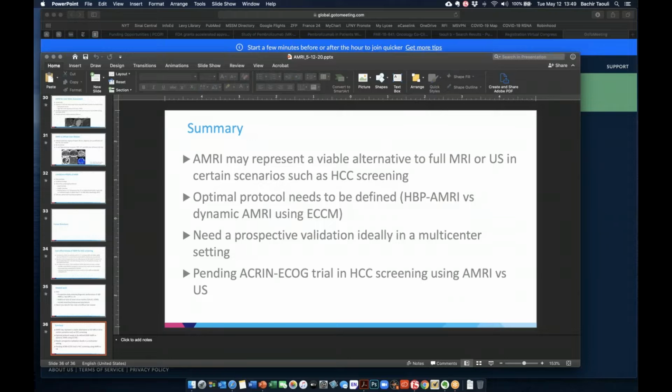So in my experience, we've been doing a prospective research study for the last 2 years on abbreviated MRI with Gd-EOB-DTPA compared to ultrasound the same day. And we have done over, I think, 50 or 70 cases total. This is really built as a research study. We're not billing it clinically yet, but I know other institutions like UC San Diego have been billing this to insurance as a limited MRI. We do not do this yet because we want to wait for meaningful results before we start billing it clinically.